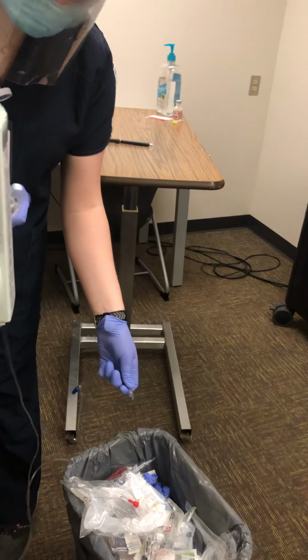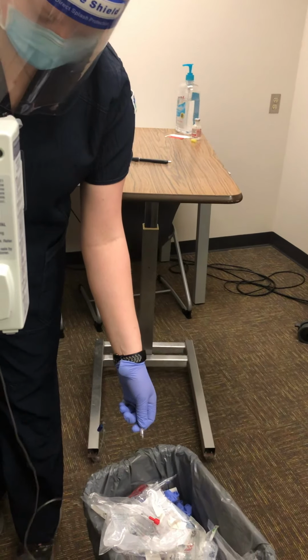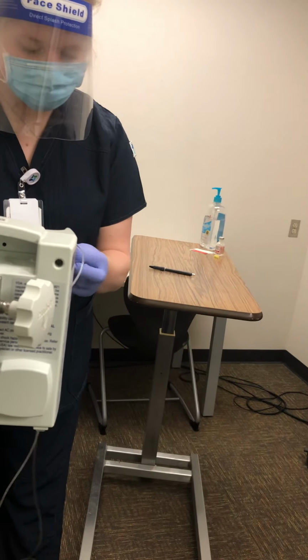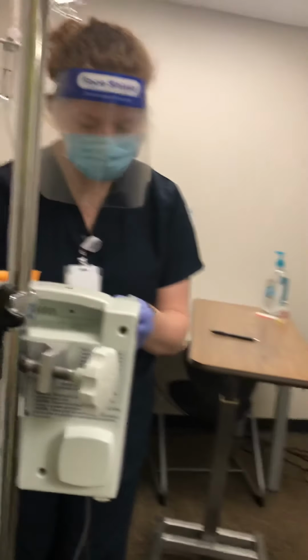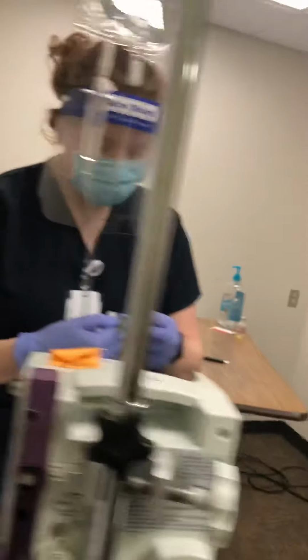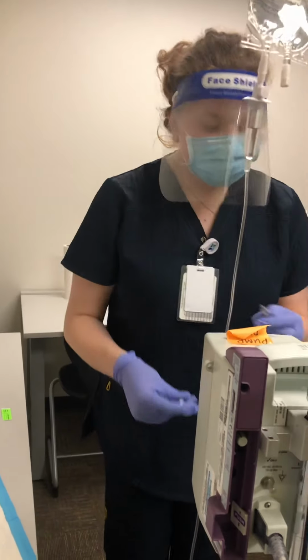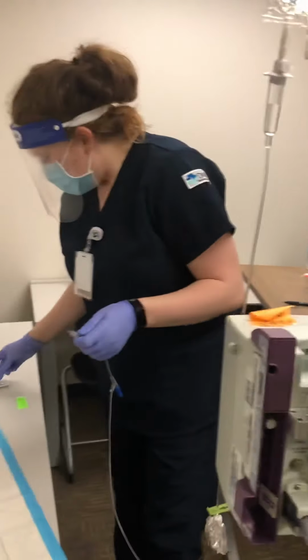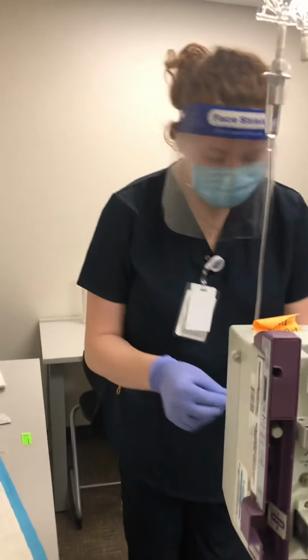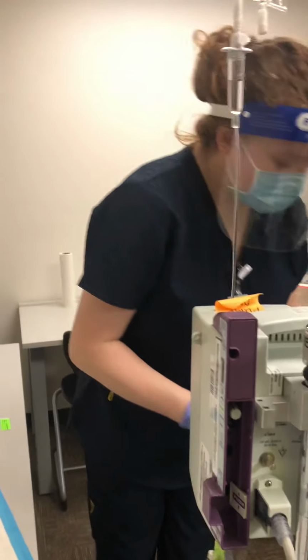We're getting our air out of the line. All right, we have done that, ensuring there's no air bubbles in the line. I'm going to close this back up with our lock here. And because I touched the end of this, I'm going to sanitize it with an alcohol wipe and then put the cap back on and do the next part.